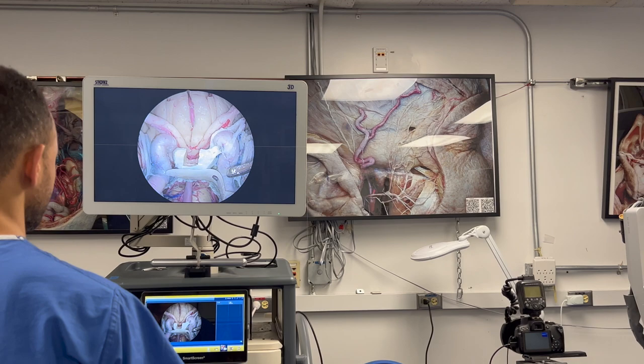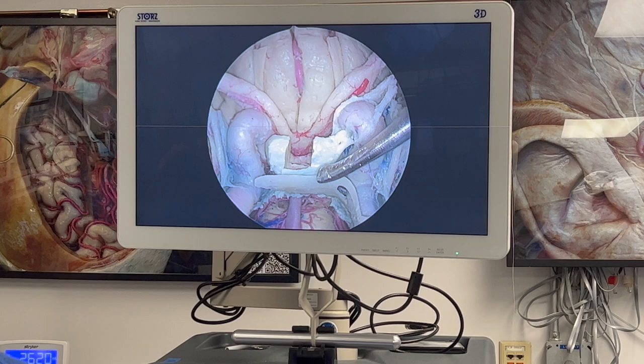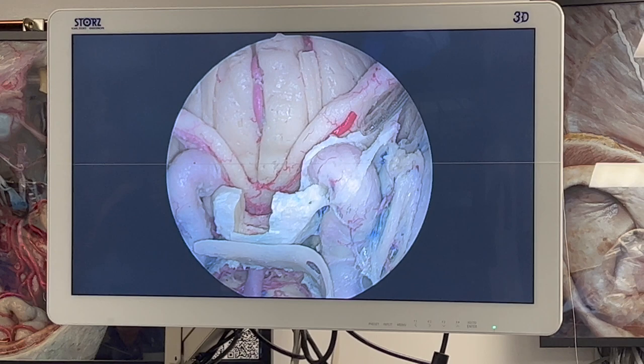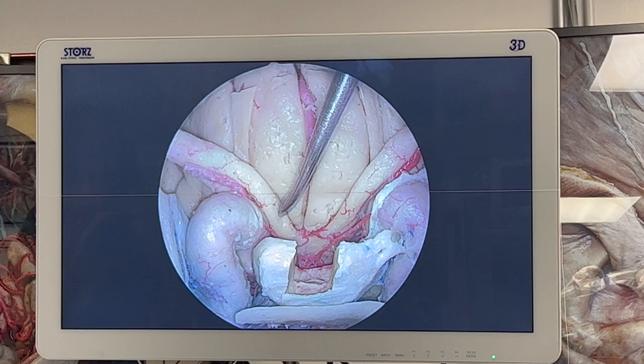I'm doing an endoscopic endonasal approach, going to the central skull base so we can see the pituitary gland. We can also see how the internal carotid artery is just there in the cavernous sinus. We can also see the optic nerve — both right and left — and this is the chiasm.